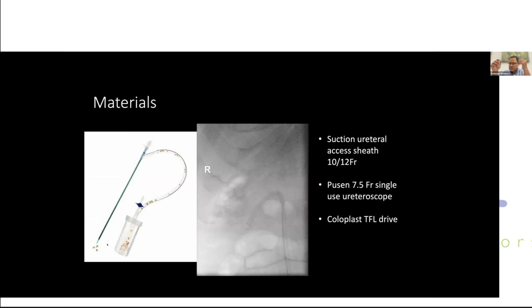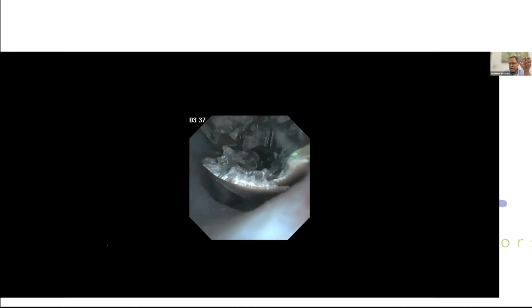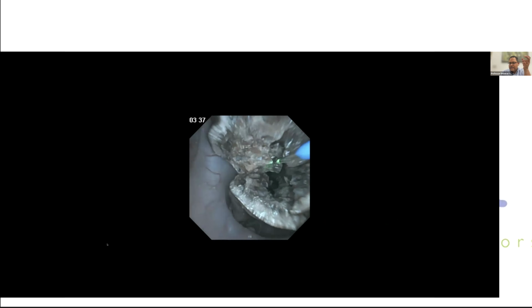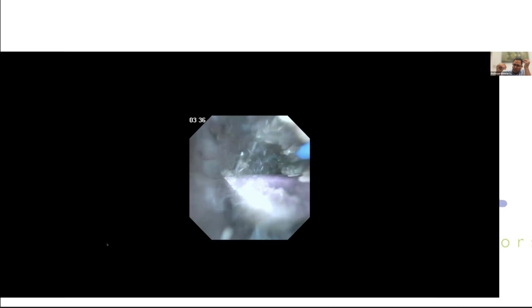So here we are using a suction sheath. It's a hard stone. The idea is to break the stone, and normally you would leave it and assume that it's small dust, it'll probably pass. But here with the suction sheath, you could bend it enough. In the lower pole, it was a 2 centimeter stone, and once I have fragmented everything, I will then use a suction sheath to actually bring out the fragments actively into the end of the suction sheath. So you're actively sucking out the fragments.